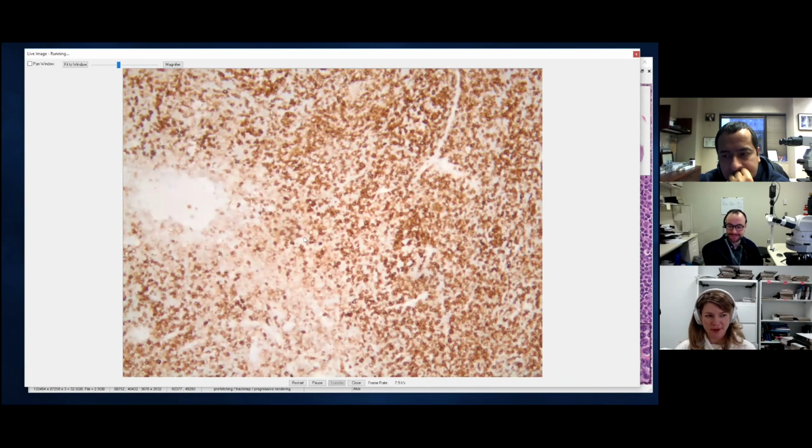So sometimes it's very clear, and I think particularly in a gastric MALT, it's very helpful because usually you have way more CD20 than CD3. They're mostly lymphocytes, and then the CD43 lights up, and you're like, yeah, that looks like it's a MALT. This one I think is a little more challenging, but I do think there is at least partial expression. But yeah, CD43 you'll see on other small B cell lymphomas like CLL. It's on those as well. So yeah, I think it is definitely helpful in this setting, and maybe more widespread availability and comfort level with that. Yeah, I think so.